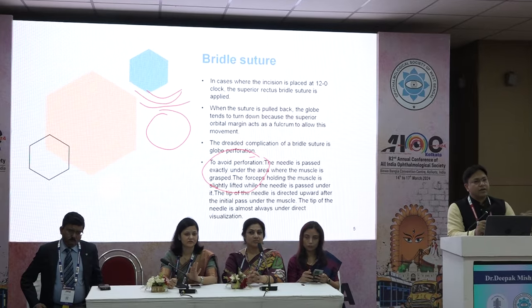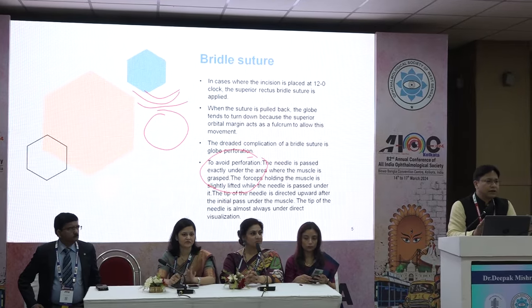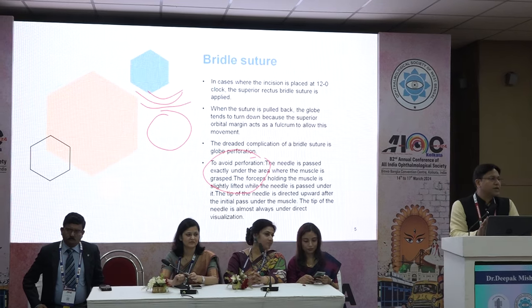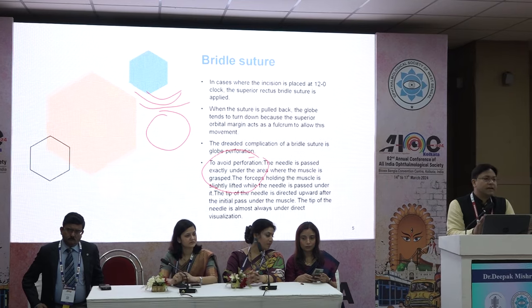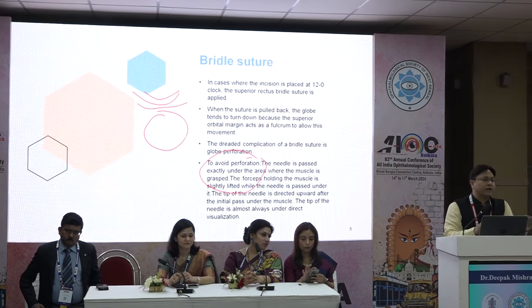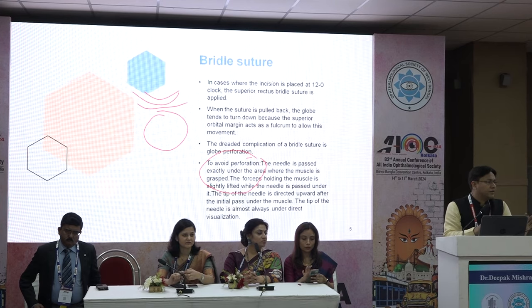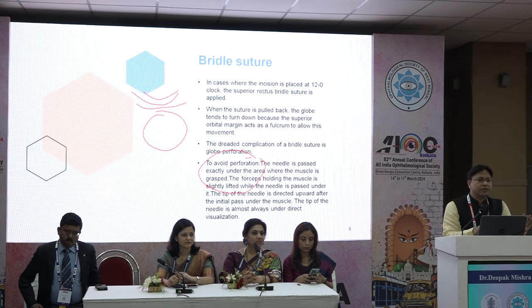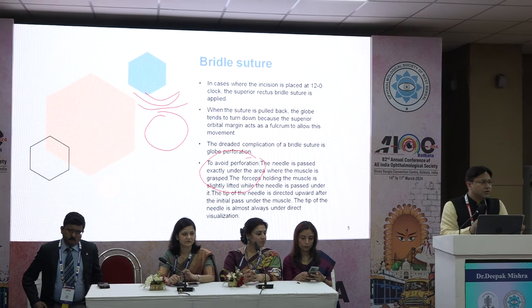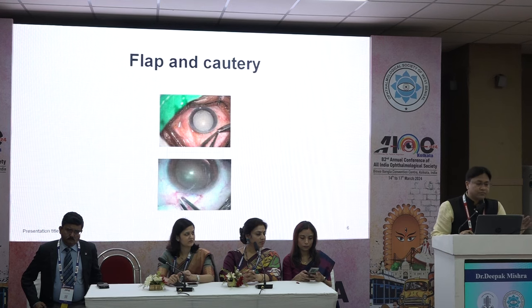If it is only conjunctival or partial, it's okay. I am telling you, it happens with all of us who have done any cataract surgery. No one can deny that they have never clamped the superior rectus, and done it correctly every single time. So it's a common mistake, or rather not a mistake, it's just a learning cycle. So for everyone, go slowly, and don't be afraid of this step.